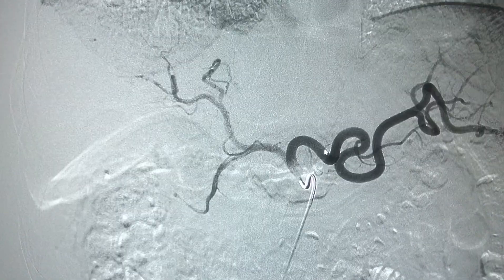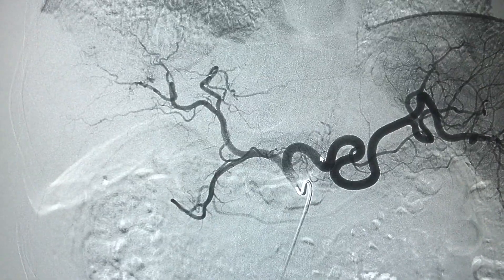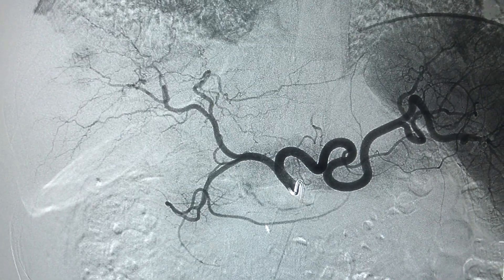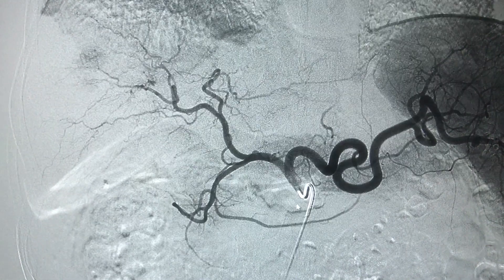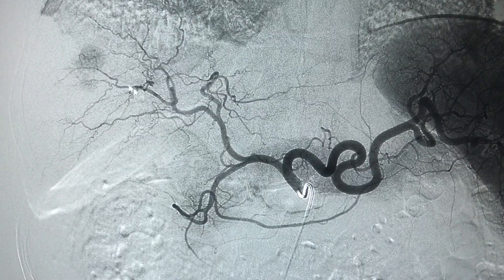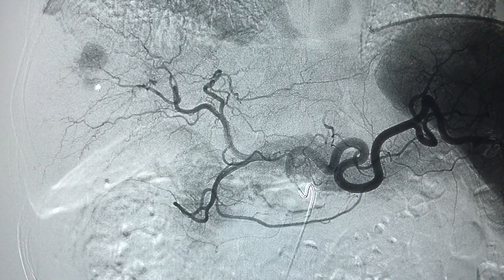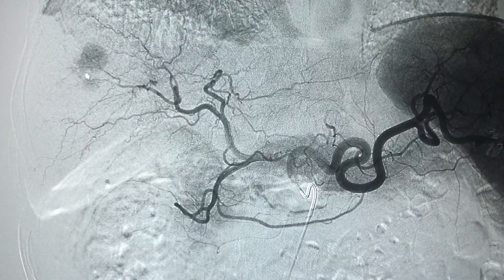We then get access into the common femoral artery and select the celiac artery with precise technique, with the celiac artery here, and at that point you do see the tumor light up in the liver with the contrast dye that's injected.